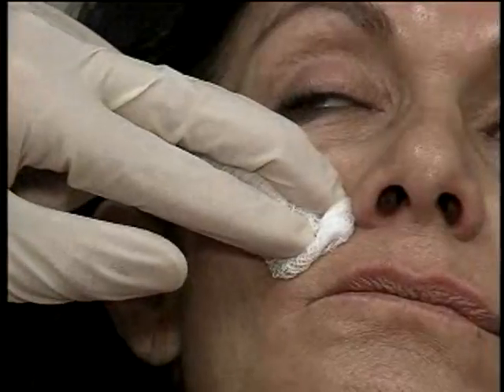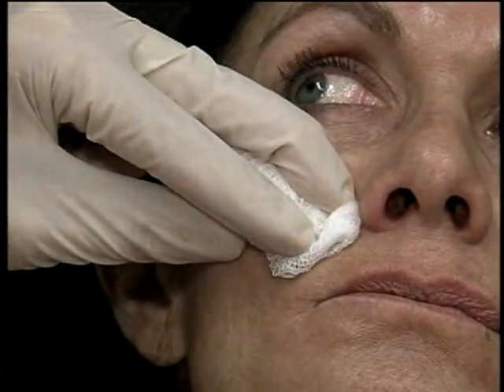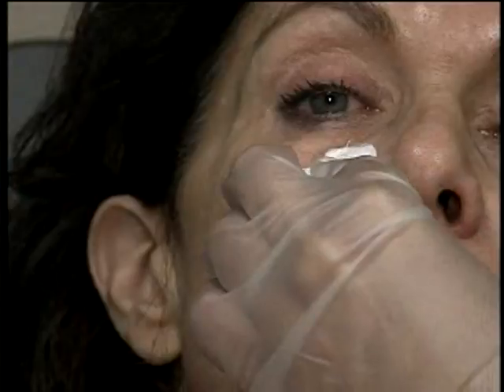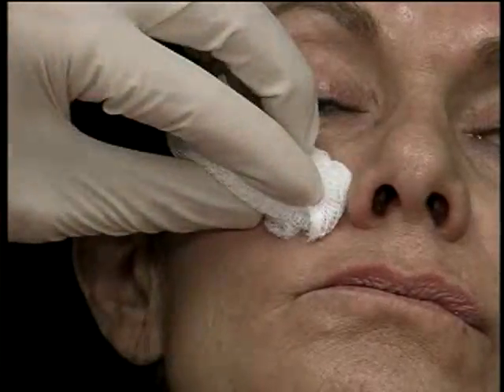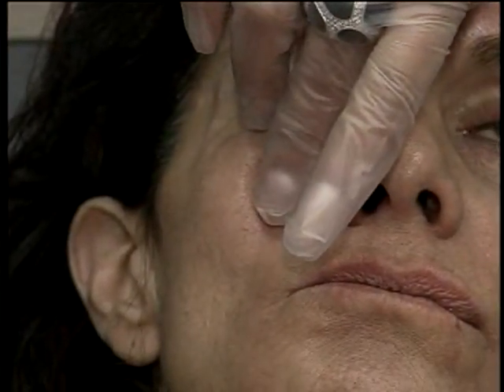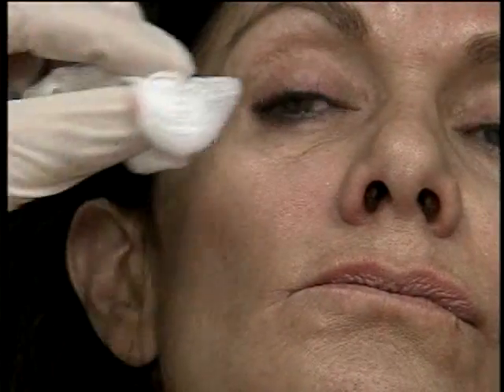Now the downside to that is you have to go transcutaneously, and patients will feel that. It hurts a little bit more. If you go intraoral, they really feel very little. And in fact, for those who want to feel absolutely nothing, you can place a topical paste into the intraoral sulcus, and it'll numb it completely. It's a benzocaine solution that we sometimes will place into the intraoral sulcus, and that will help reduce any sensation of discomfort.